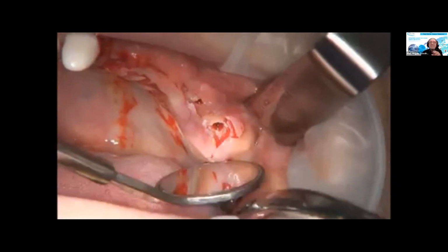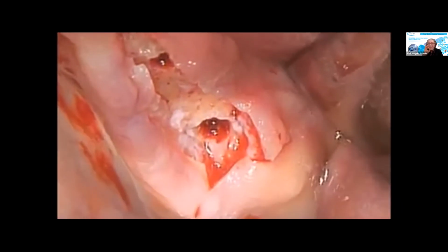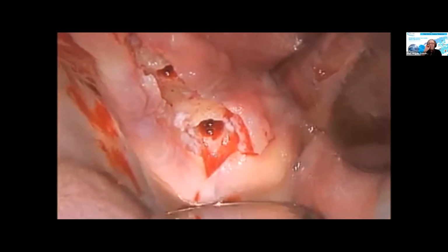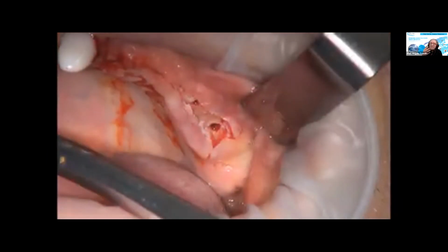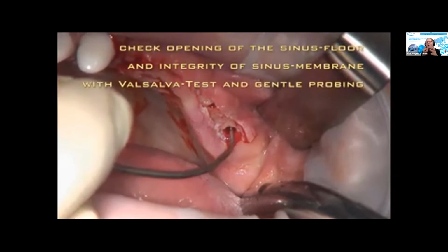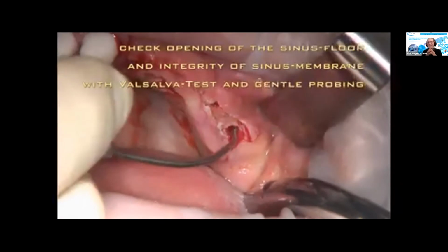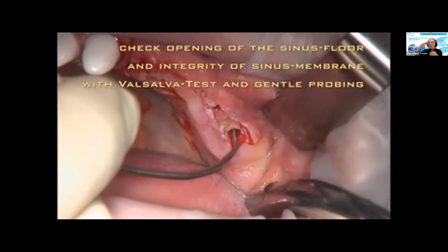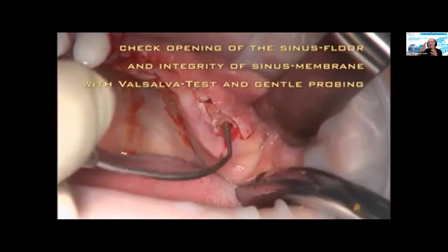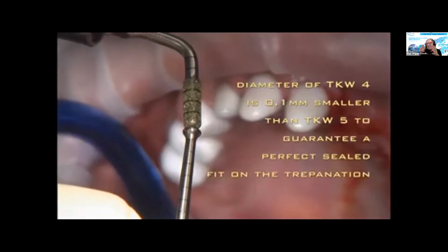So once you open the sinus floor, hopefully you can see it. Even if the sinus membrane is not detached already, you see a slight movement synchronous with the breathing of the patient, because there's always some criticism that you have not so much control over the surgical procedures because you don't see. No, but you can use indirect signs of being effective, because if the blood column or the saline solution moves synchronous with the breath of the patient, of course, you know the sinus floor is open, but since there are no gas bubbles or air bubbles, the sinus membrane is intact.